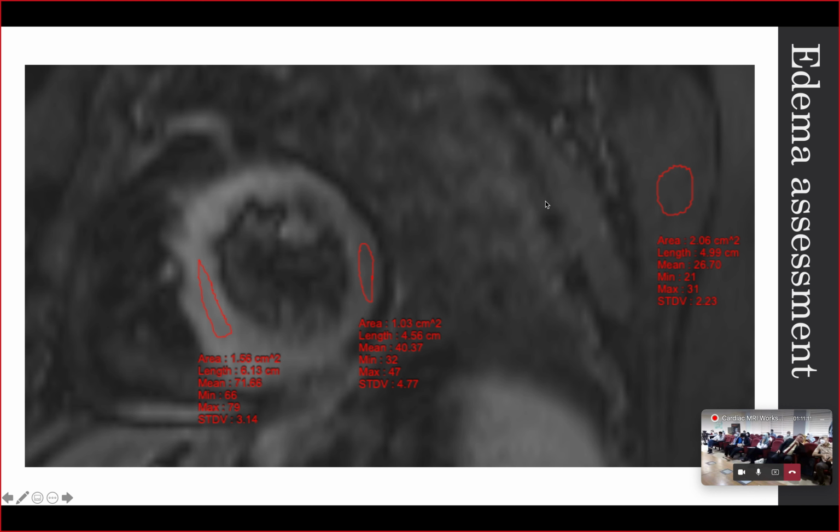Now software measures the amount of edema in the affected territory in relation to the remote unaffected myocardium. So if the average signal exceeds the average signal in the unaffected territory plus 2 standard deviations, this reflects edema, and the software will take it into consideration.